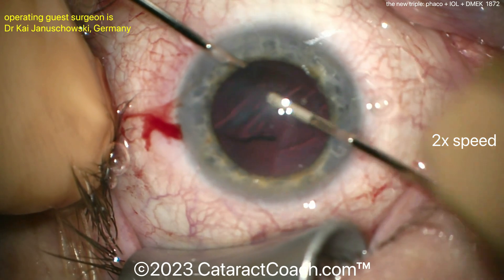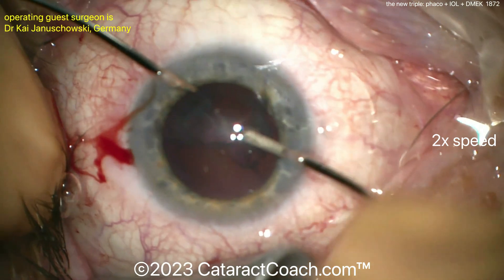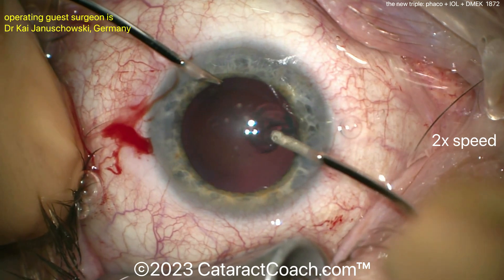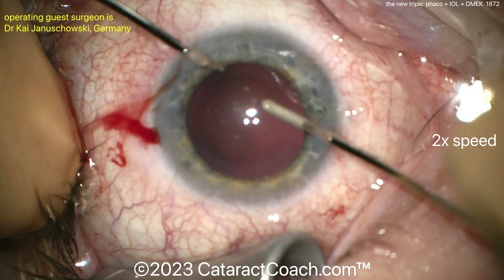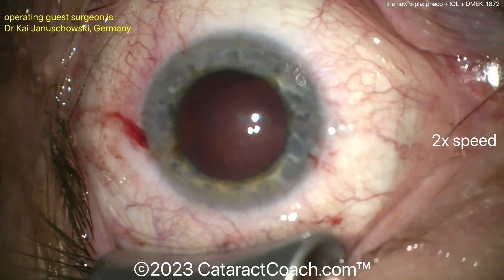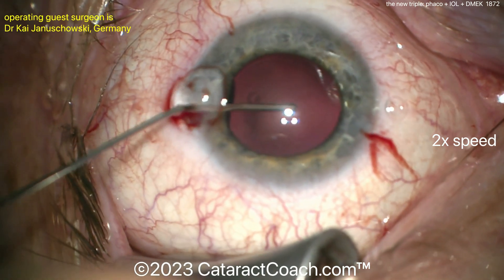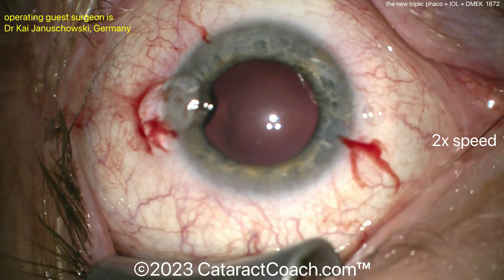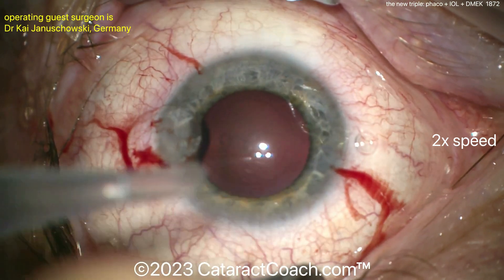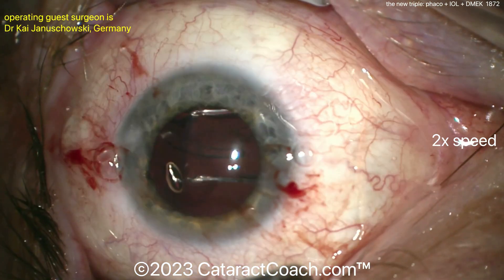Now, when you get DMEK grafts these days, the nice part is you can get all these grafts already to your specifications. When I was doing these with the residents, we would get them already cut to the desired size. Obviously the lamellar cutting has already been completed. You can get them stained already with tri-pan blue dye, and even marked for orientation with a letter S or something, so you can see if the graft in the eye is correct or upside down. You can even order them already in an injector, ready to be placed in the eye.